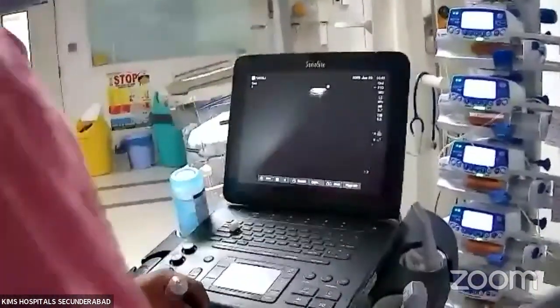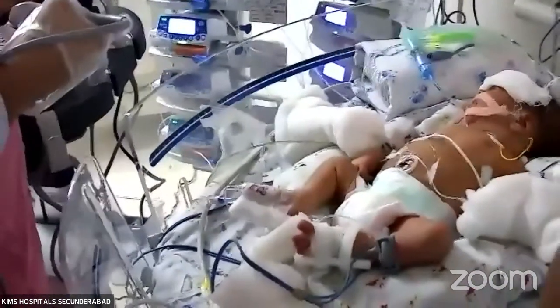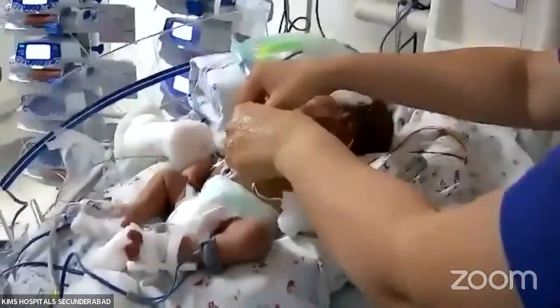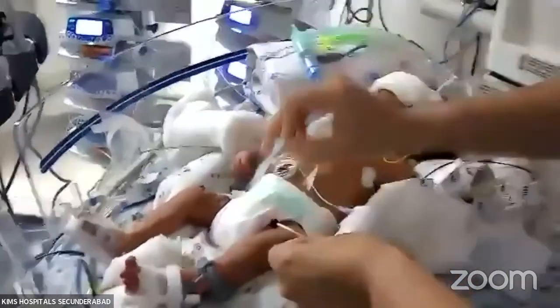Now I'll go with one thing. Can you please remove that? Okay, now we'll go through four things. First, the chamber localization, pressure, IVC, and the catheter. All those things we'll see.